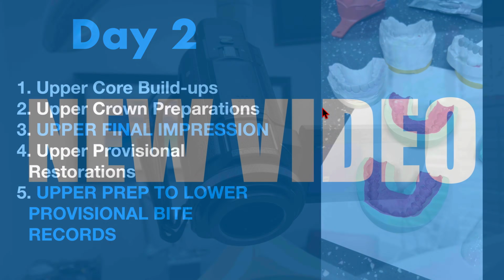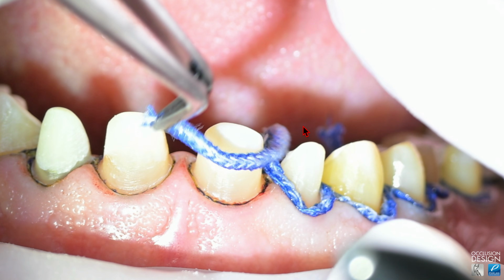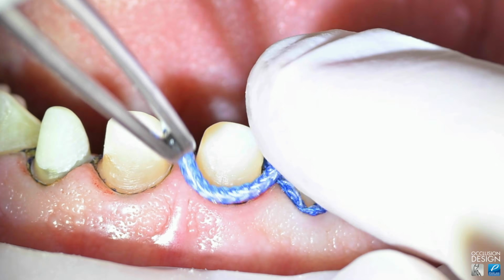So there's day 2. On day 2, I shot a lot of video that I showed during the webinar. I showed videos of doing the cores. There were different things that we had to do to get the cores to work out well with clamps, etc. I like to show that because it helps troubleshoot for members and their restorative cases. Even if they're not doing a full mouth case, they get tips from that. And then this is just the last part of the video. I just put a little clip in.